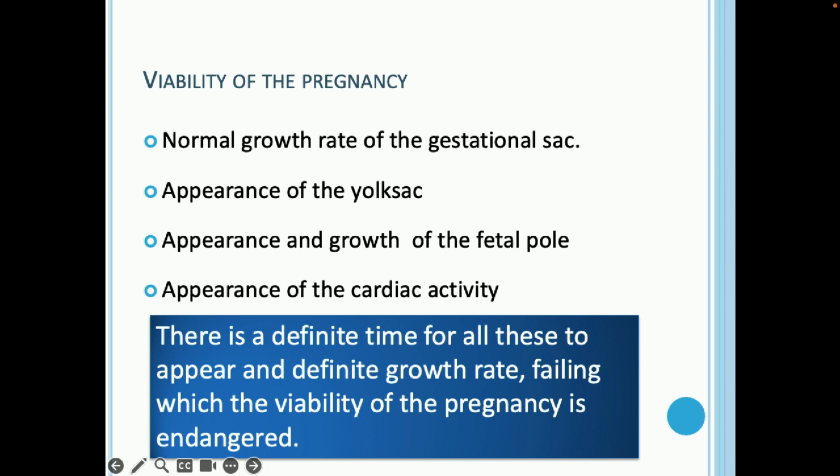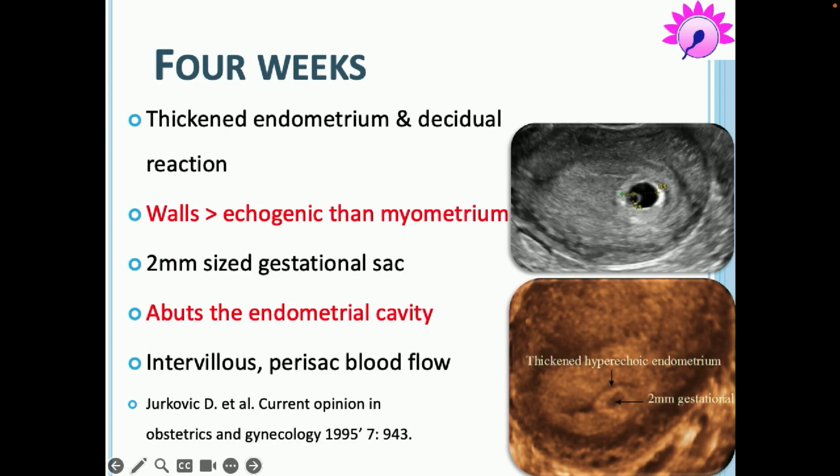These all things have normal timelines and growth rates, and they have to follow that to tell you that the pregnancy prognosis is good.